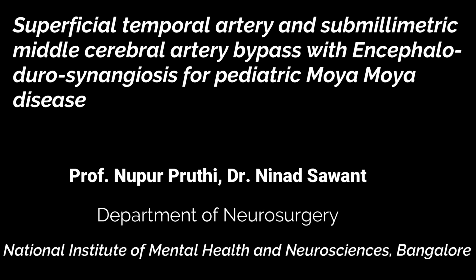We present a video of superficial temporal artery and submillimetric middle cerebral artery bypass with encephalodurosynangiosis for pediatric Moyamoya disease.